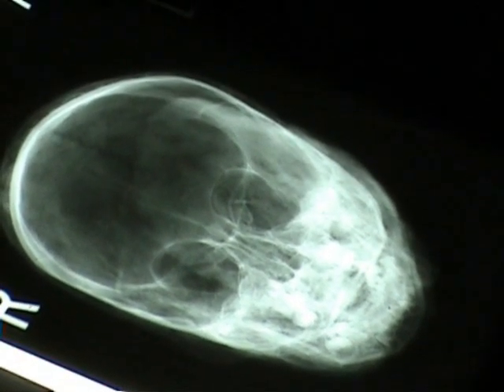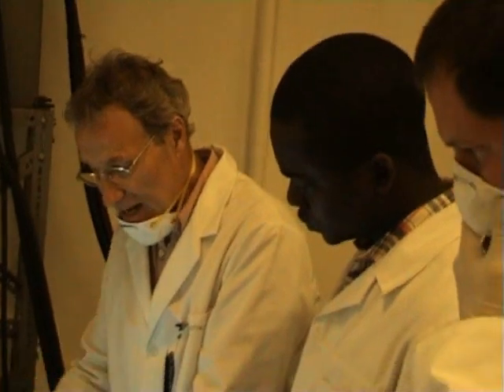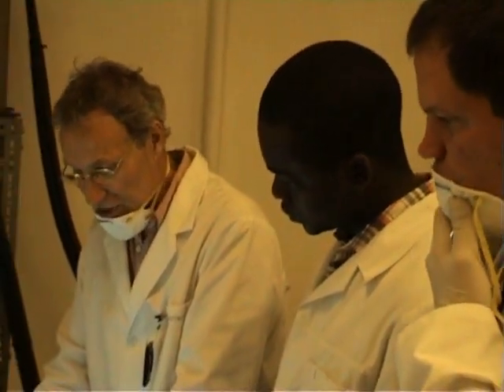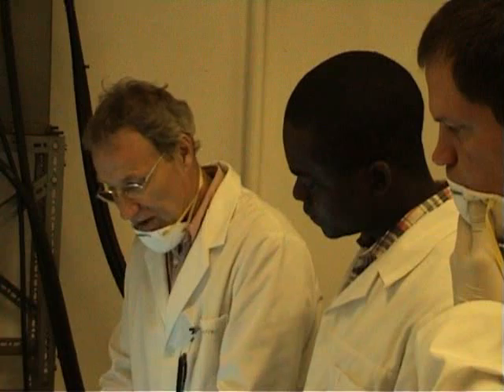So what we'll do is just try and straighten it up. Then I'll go through the process of doing what we'll call the Towne projection, and then move on to the lateral, because we know the exposure factors are right.